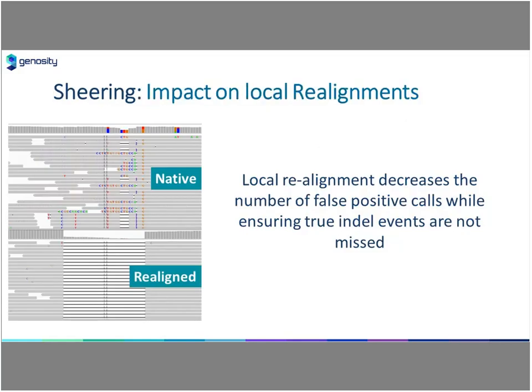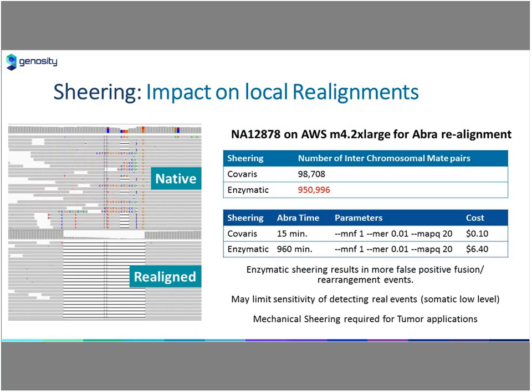And so here's one of the key things when we look at informatics and the processing of data. Part of the informatics process, the pipeline, is aligning reads to the reference genome, and then we go through this realignment around local indels. As you can see in the schematics on the left here, coming out of the aligner, we see many what would appear to be variants present in the data, but after doing a realignment, we see that there's actually an indel there.